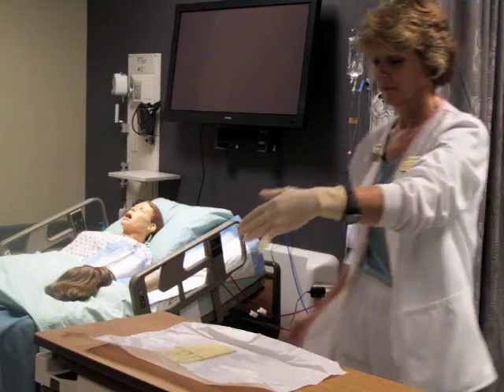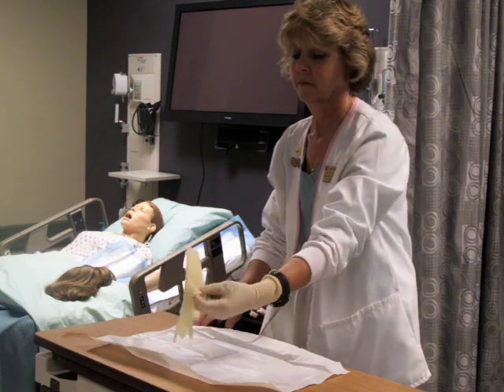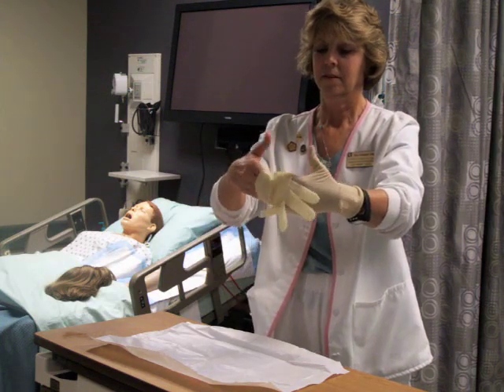For the next glove, go in and grab the cuff with your thumb and fingers and get a good grasp, letting gravity be your friend. You then hitchhike the thumb and insert the other hand into the glove.